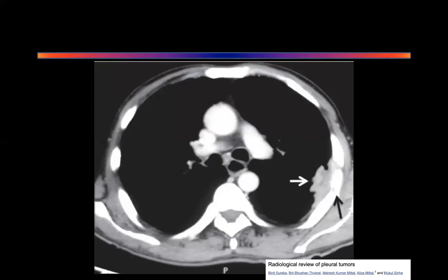Can it be one of the chest wall tumors? Okay. How do we differentiate them? What else can it be? The reason why I put this at this stage is you must think of something coming from outside the chest. Can it be a cold abscess of the rib? Unlikely, because the ribs are not showing. What else will happen in the pleura?